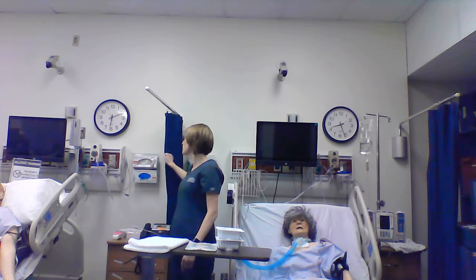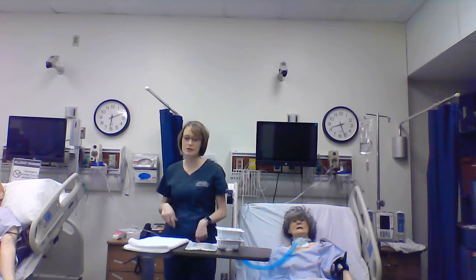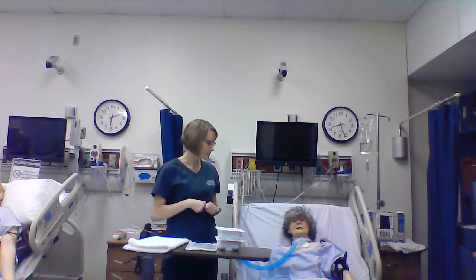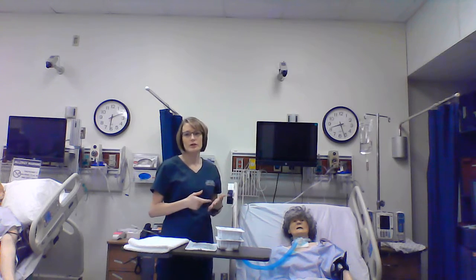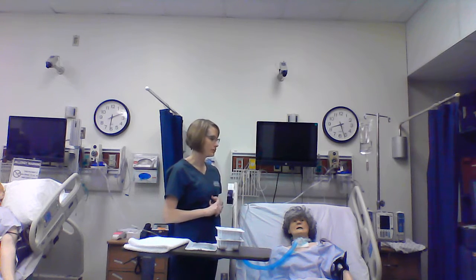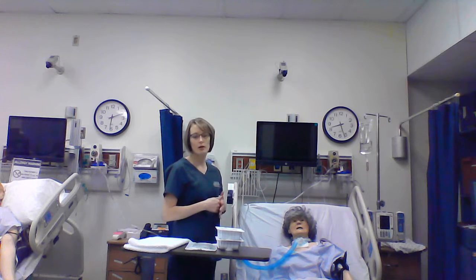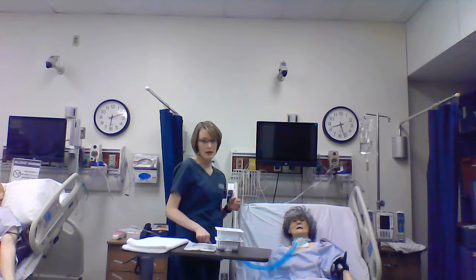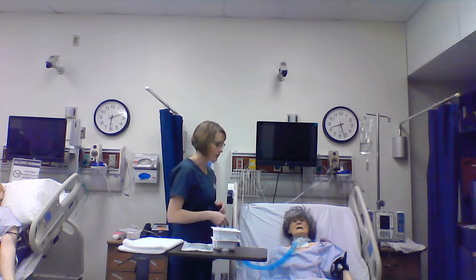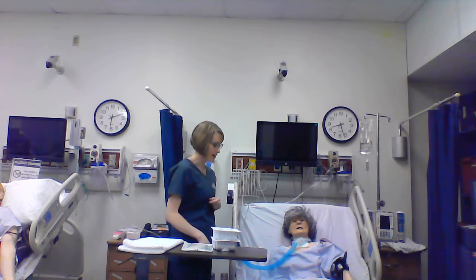I'm not going to pull this curtain because my oxygen and suction are back in that corner, but you would want to provide them with patient privacy. I want to make sure that they're alert and oriented ×3, and then I would take my stethoscope and listen to their lung sounds. I want to note their rate, depth, and breathing effort and the rhythm to determine whether or not they need to be suctioned as well. And if they need to be suctioned, then we'll perform that too with the tracheostomy care at this time.